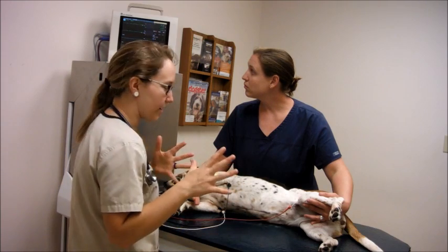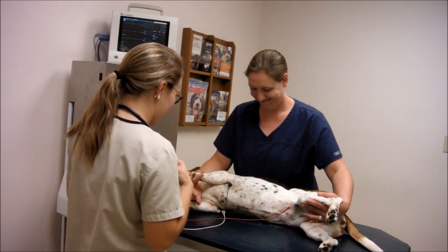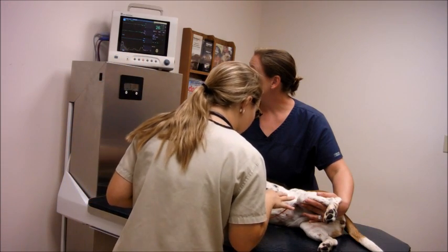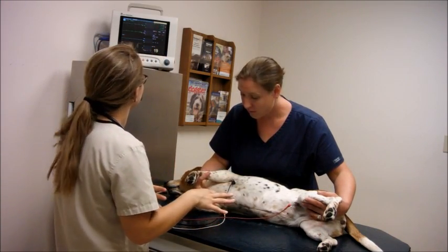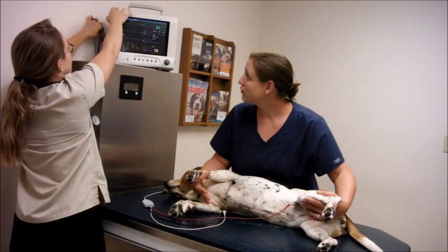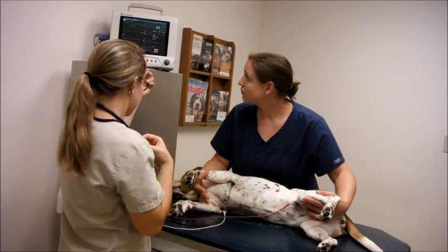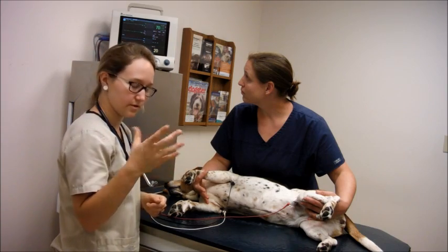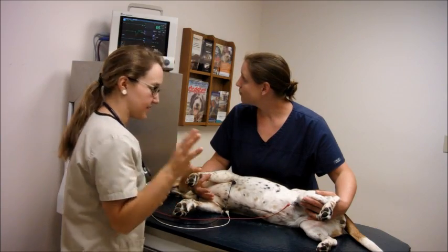It's giving us some alarms right now because it's trying to adjust to her body — it's telling us the heart rate's too low, but that's not her real heart rate. I want to make sure my leads are in good placement, which they are, and that they have alcohol. Meg is holding her so that her legs aren't touching and none of the metal of the leads are touching either. I'm also going to check the hookup to the actual machine. This machine is picking up the respiratory rate as well. I have the other monitoring alarms — like SpO2 and blood pressure — turned off since we're not using them right now, but I'll turn those on before surgery again.